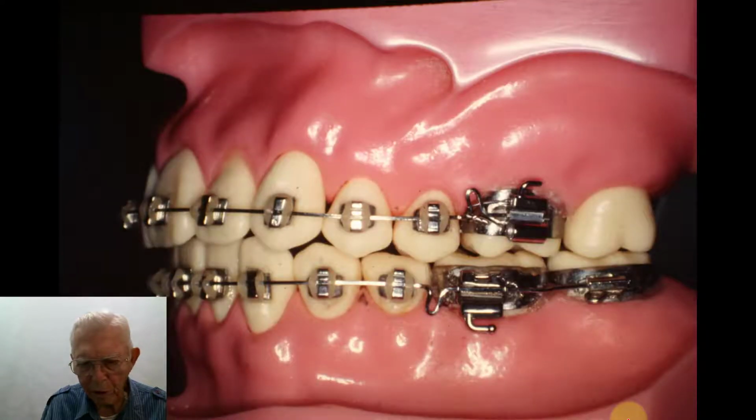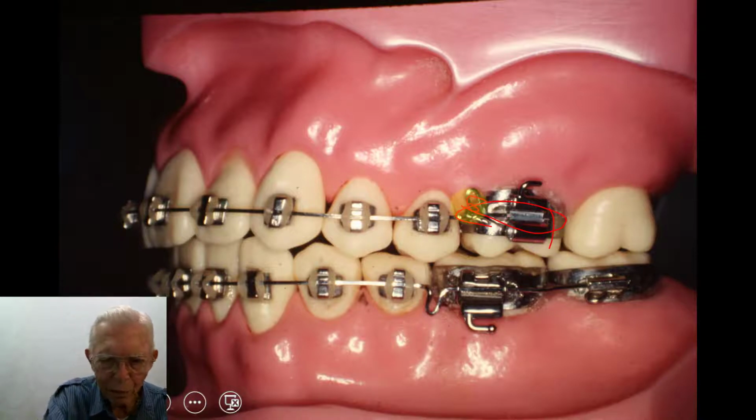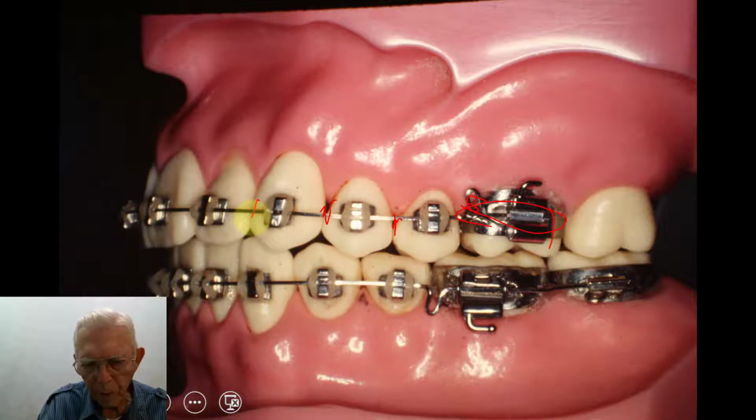Now this is from the other side of the mouth. Maybe you can see the omegas. We tie all of our arch wires back. We can cut them off where we want them there, and we tie one side and come over and tighten the other side, and you can actually blanch the tissue if you want to move the teeth together. I don't care if they say they don't slide on the arch wire. You tighten them up and they'll slide on the arch wire. Or if they're pinched down so tight they can't slide, you better take a little tiny screwdriver, go in there and twist it a little bit and open that bracket up like that.